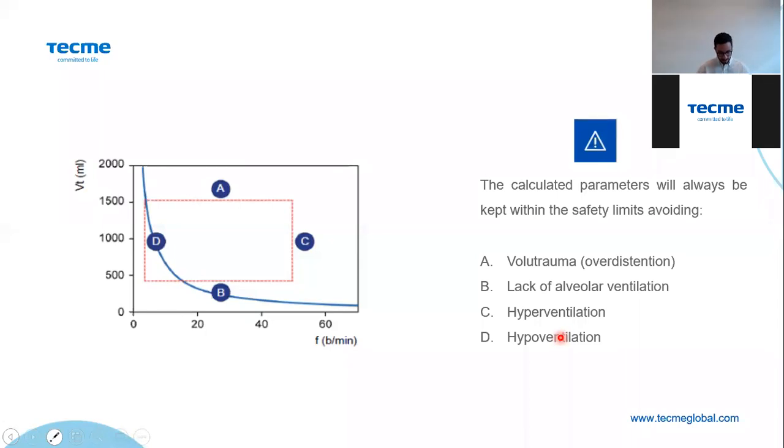So the ventilator will start to measure the compliance and the resistance of the patient, and it calculates the expiratory time constant, okay? With this information, the ventilator will calculate an optimal frequency using the Otis equation, okay? Using this equation, the ventilator can calculate this frequency, and with this frequency, it also calculates the ideal tidal volume, okay?